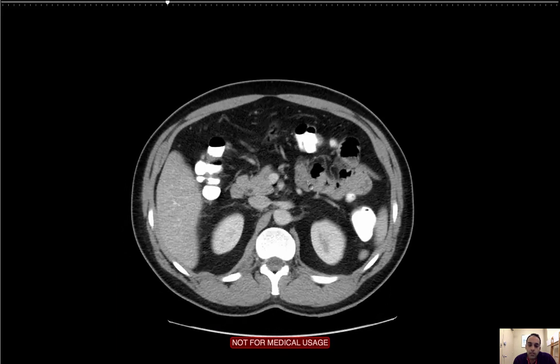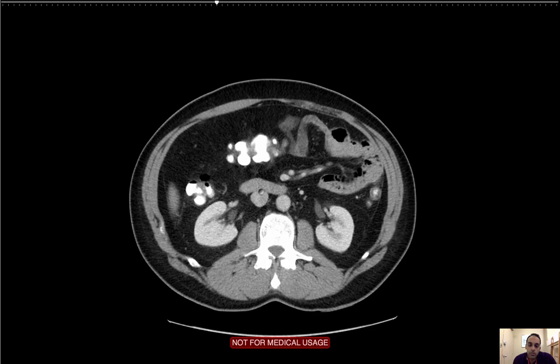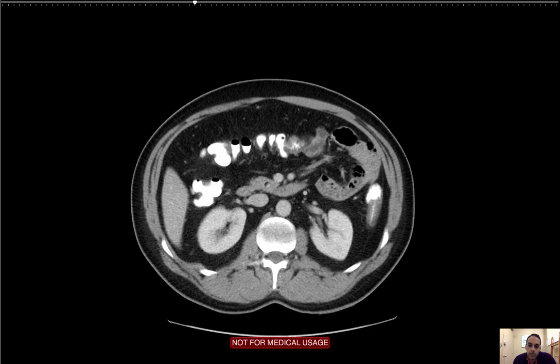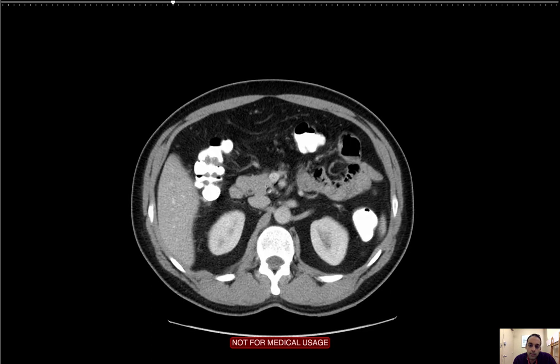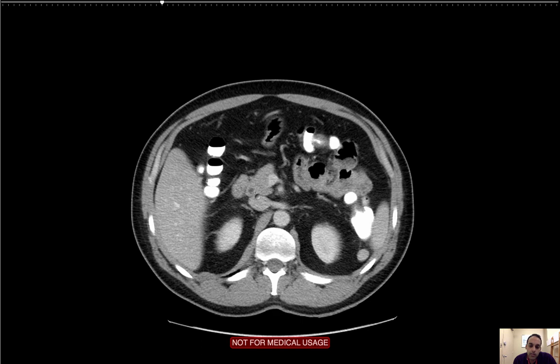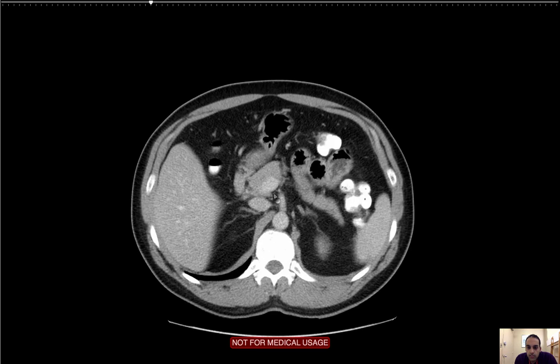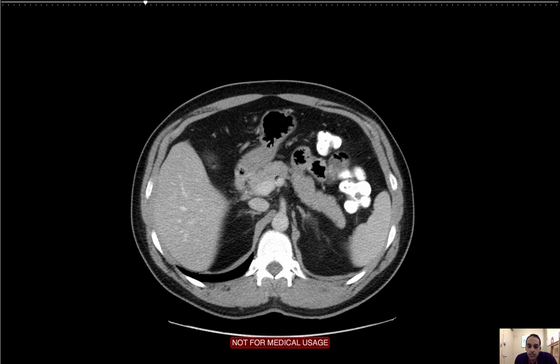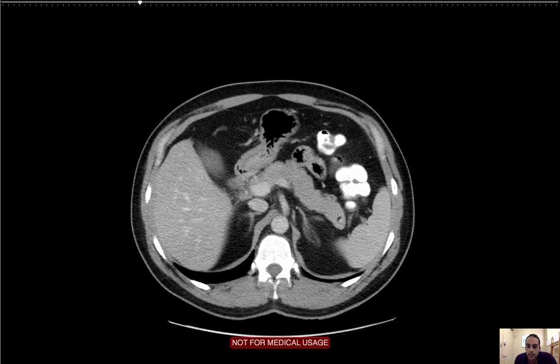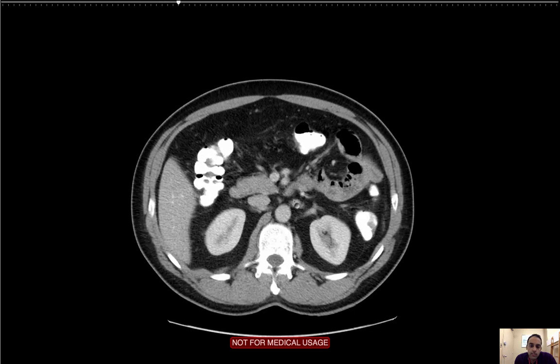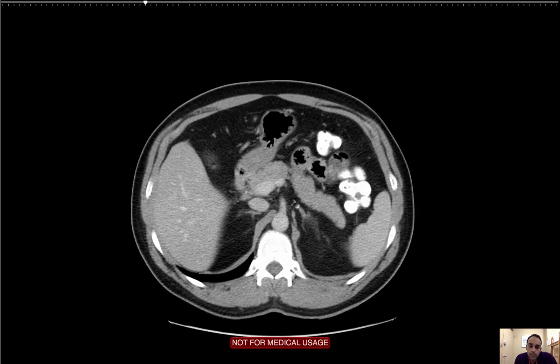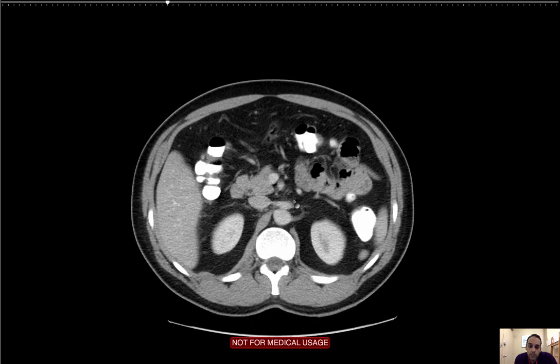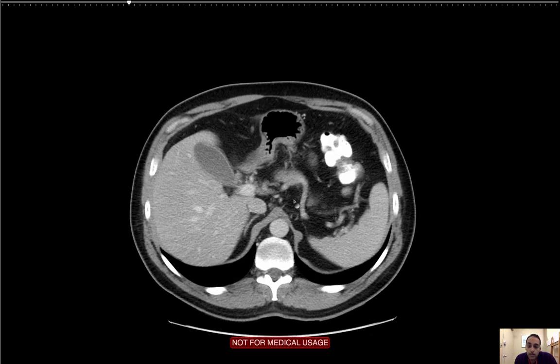I'm going to come to the pancreas. Starting here at the third portion of the duodenum as it comes across the retroperitoneum. Coming up, I start to see the uncinate process of the pancreas, then the head of the pancreas, and the common bile duct within the head, curving right along the superior mesenteric vessels — the artery and the vein. The neck, body, and tail of the pancreas are visible. I'm basically looking for focal lesions and diffuse disease such as pancreatitis, any fluid collections. I'm not seeing any of that. The pancreas is unremarkable. There are no focal pancreatic lesions.